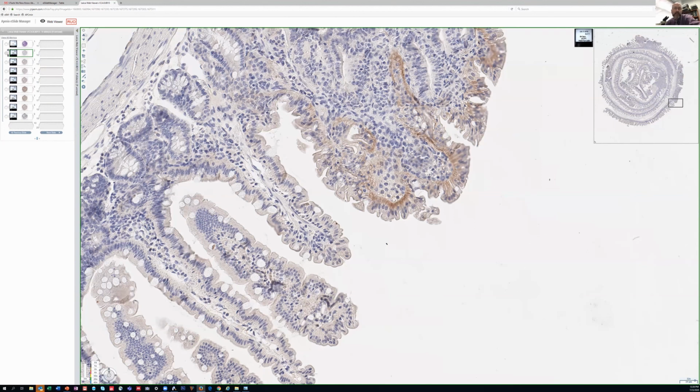You could also, if you did single cell RNA-seq, see if there's RNA for the non-neoplastic stuff, which you could follow as well. Again, it's just a surprise, obviously, given the extensive history of EGFR and colon cancer. You're just expecting it in the adenoma.